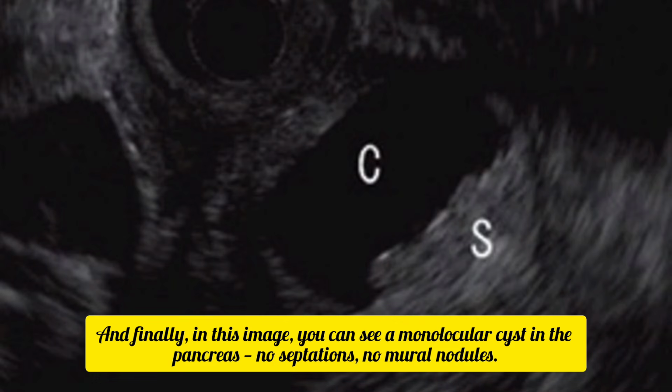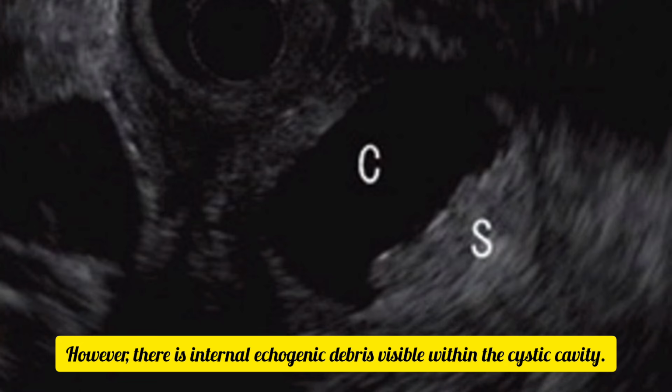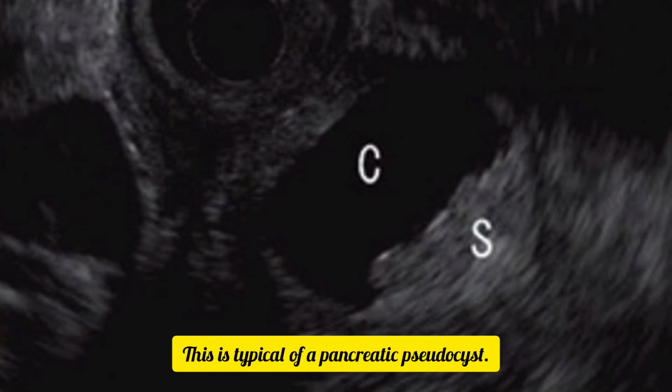And finally, in this image, you can see a monolocular cyst in the pancreas. No septations, no mural nodules. However, there is internal echogenic debris visible within the cystic cavity. This is typical of a pancreatic pseudocyst.